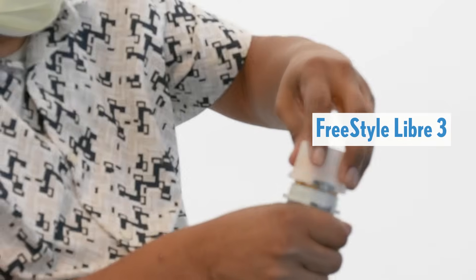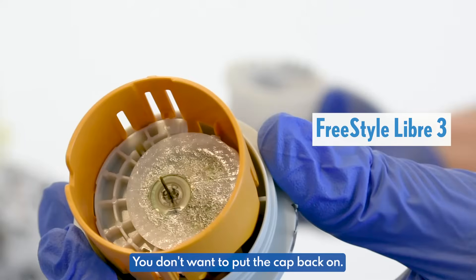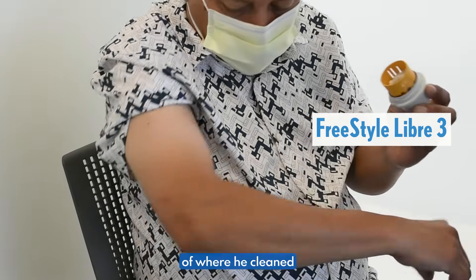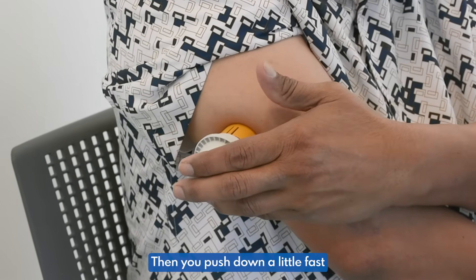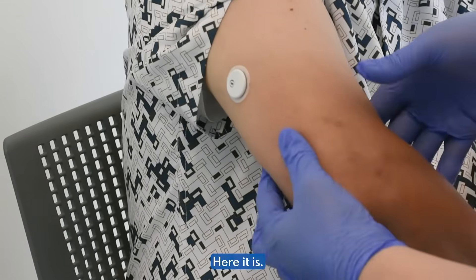Open it up and twist it. You don't want to put the cap back on. He's going to place it right on top of where he cleaned. And then you push down a little fast — and that should do it. Here it is.